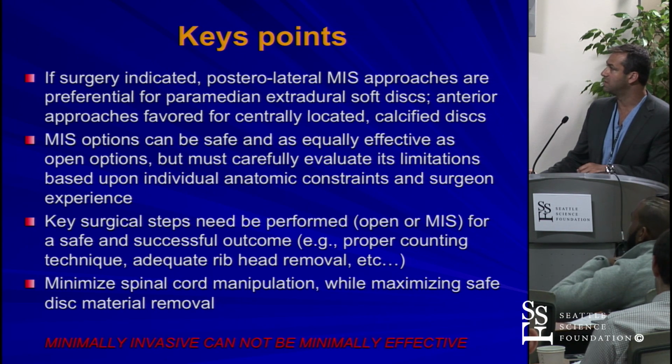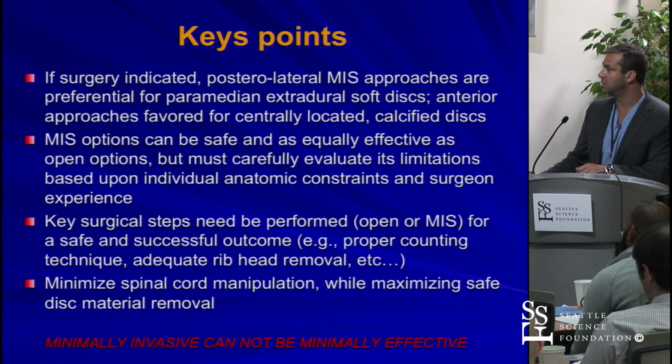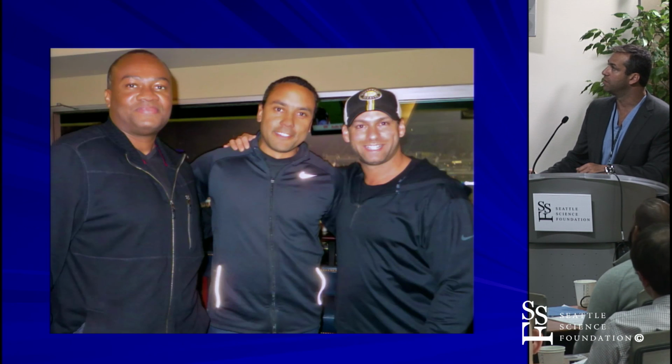Key surgical steps need to be performed no matter how you're performing the procedure. You need to get the pathology out, and you need to do so in a way that minimizes cord manipulation and maximizes removal of the material.